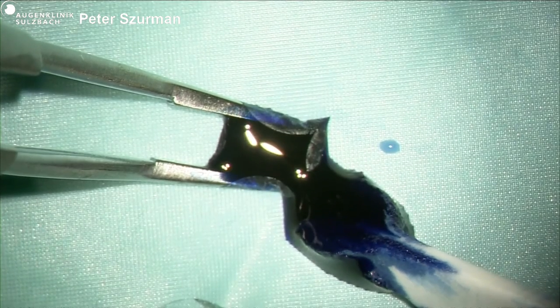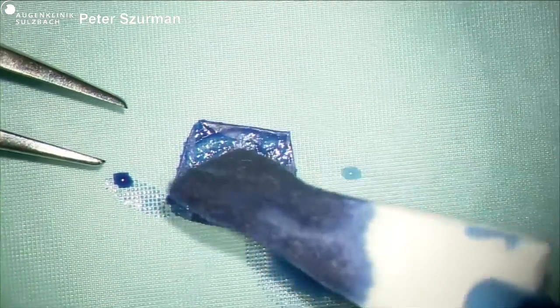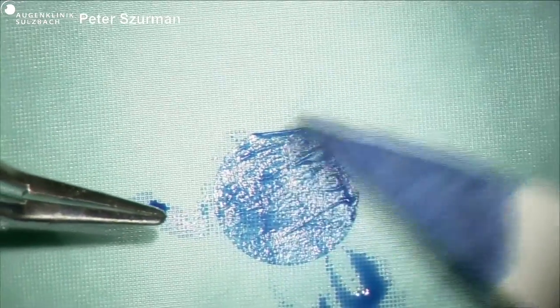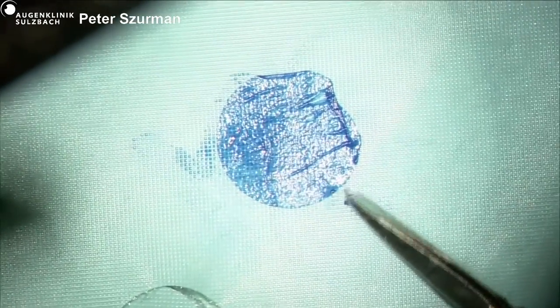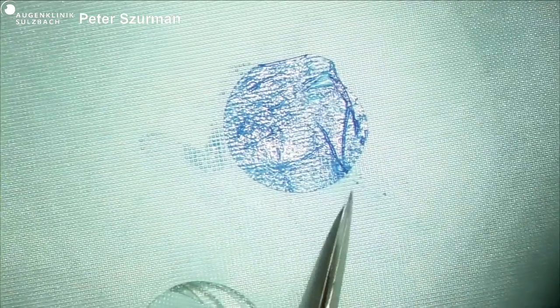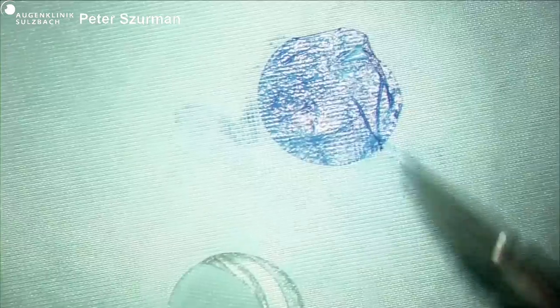Indeed, you need something to cover it, as you don't want to use laser, of course, due to the position of that break. An alternative to amniotic membrane is to take a piece of retina from the far periphery. There is a quite strong laser treatment at the mid-periphery, at the equator, but the anterior part, the retina is still there. So you can take a piece of retina and use it like this. Instead of putting it on top, retina is softer, more elastic, and you can fit it better under the break. And so this is my alternative. But I think definitely you need something to sit better. So a patch, and Klaus.